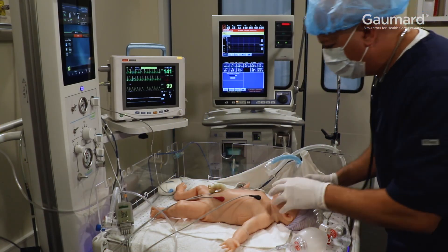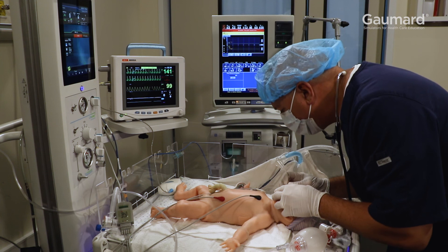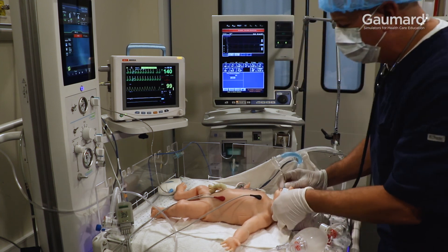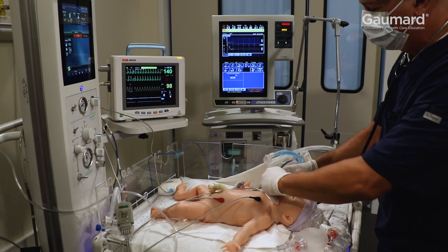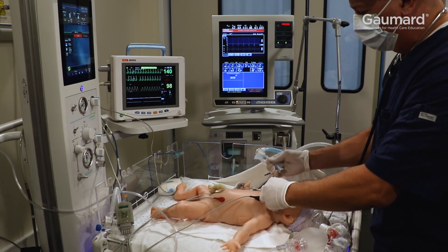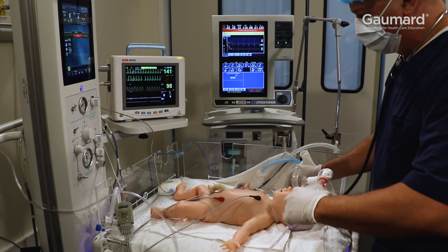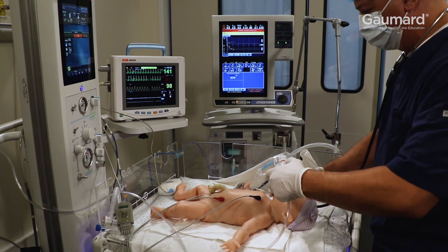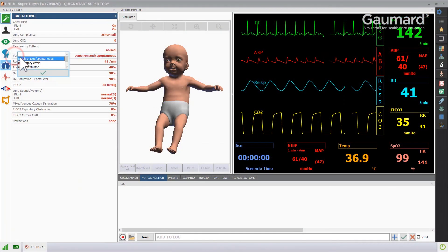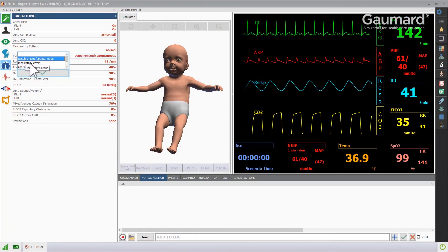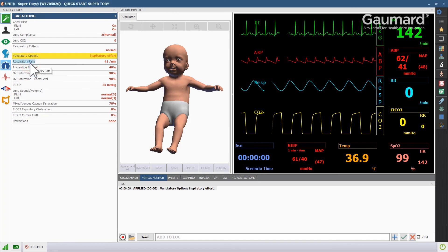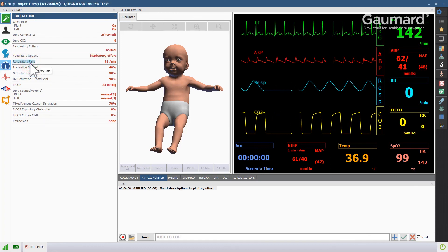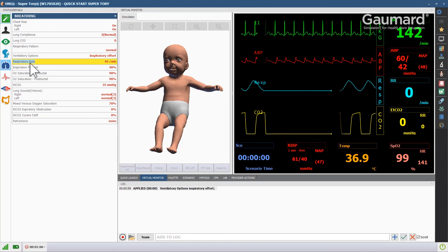This automatic drive can be overridden to simulate a failed weaning protocol or an accidental extubation. Click the ventilatory options vital and select 'Inspiratory Effort' to program SuperTori to maintain the small inspiratory gasps even when the ventilation rate falls below 15 per minute.